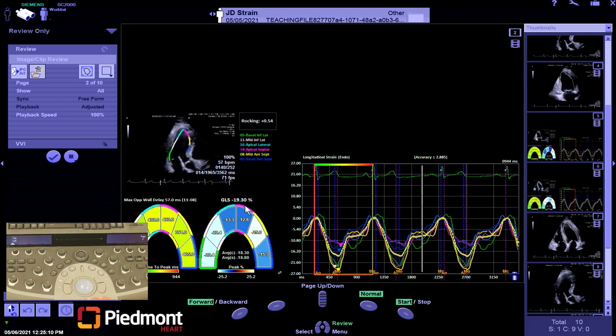And in specific rhythms, such as atrial fibrillation, PVCs, ectopic beats that are in a pattern of bigeminy. Again, for bigeminy, trigeminy, you would not really want to acquire or process any of that data, and the same with strain for AFib, unless you can get the patient's heart rate to an ideal consistent R2R interval without a PVC or PAC that affects it.